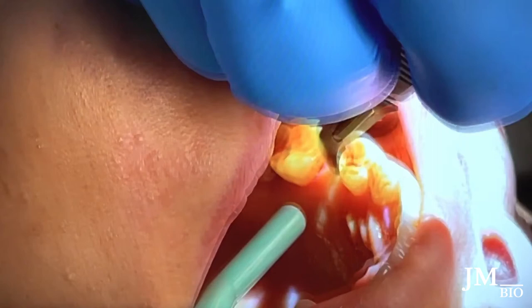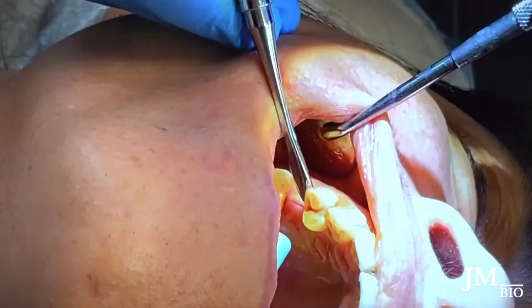The way I use my periosteal elevator — I love to use the tooth as a fulcrum because it doesn't slip. When tissue tears it's because your instrument slips. I put the periosteal elevator in and use the adjacent tooth as a fulcrum to lift the tissue up. Once it's separated, I use the back molar to elevate off. There's no slippage and the tissue comes out clean.